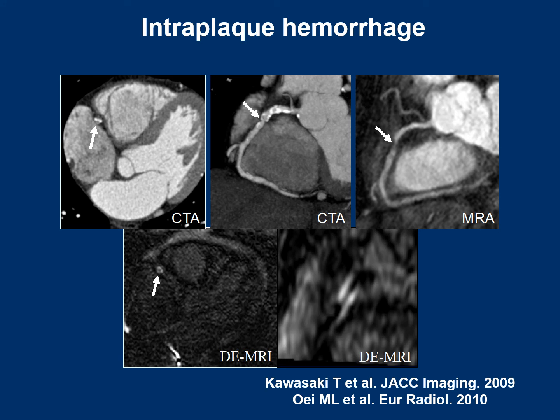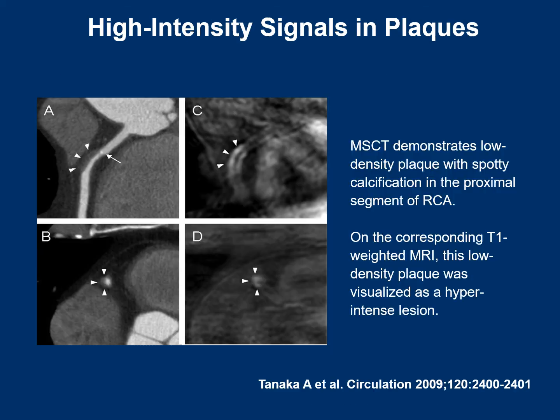The typical high-intensity plaque stands for intraplaque hemorrhage, with positive remodeling, remarkably low computed tomographic density, and high incidence of slow flow phenomenon. Non-contrast T1 weighting in cardiac MRI may be useful for the assessment of coronary plaque characterization in patients with artery disease.